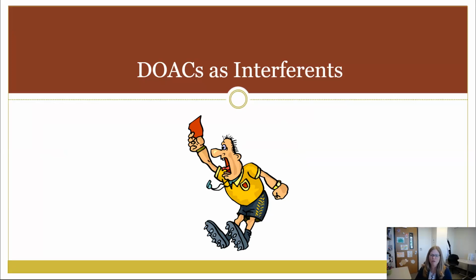Okay, now we will move on to talking about direct oral anticoagulants and how they might interfere with common coagulation testing. I think it's important to note that when these medications were approved for patient use, they were approved without requiring routine monitoring by laboratory testing, which was a huge benefit for patients relative to warfarin. But because of that, some providers might assume that because these medications don't need routine monitoring, they might not interfere with any of our coagulation testing that might be performed for other reasons. And that is not true. And so that's what we'll talk about next.